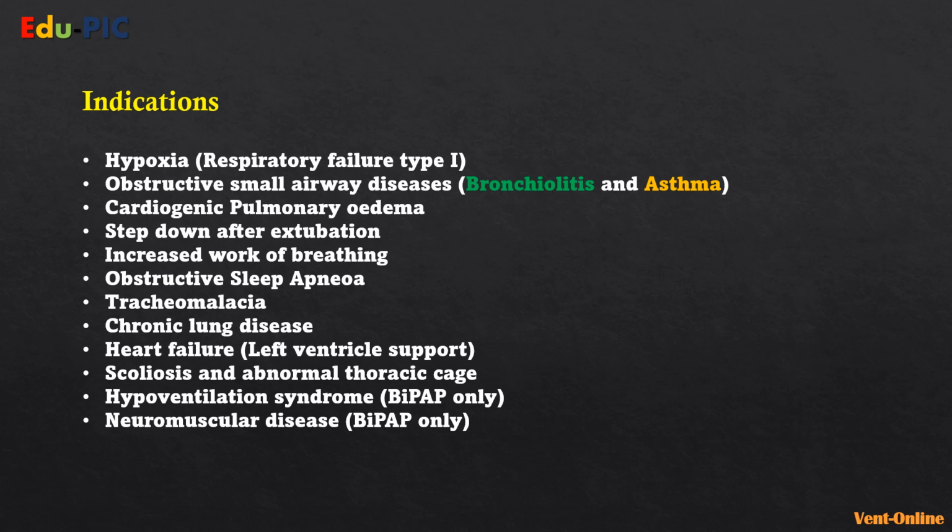It's useful as a step down after extubation, and we kind of hinted on that, and there is also more evidence to support that. It's good to tackle increased work of breathing. It's obviously very useful with obstructive sleep apnea, tracheomalacia, chronic lung disease. Again, because it supports the heart, as we said, it's useful in heart failure. Sometimes we just use it with heart failure patients where we just put them on CPAP, and that's mainly for left ventricular support.